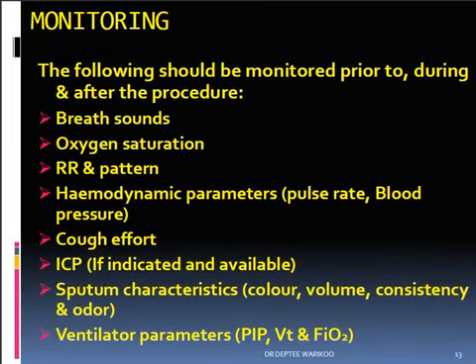Then you will monitor the patient. What all things we need to monitor while performing the suctioning technique? First, the breath sounds. I have already told you, no coarse breath sounds should be there. Oxygen saturation, respiratory rate and pattern, hemodynamic parameters like pulse rate, blood pressure, cough effort, then ICP, then sputum characteristics.